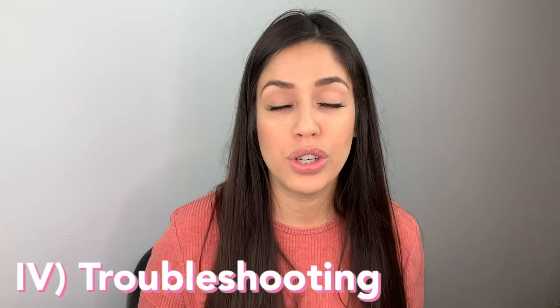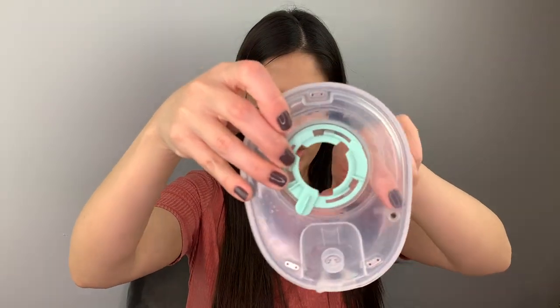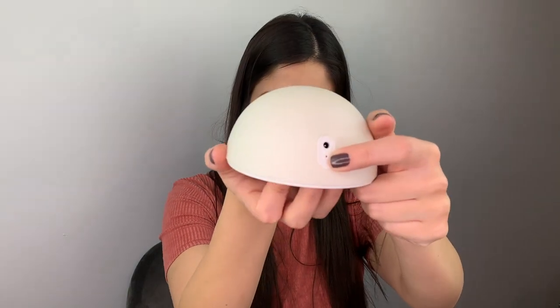Moving on to the troubleshooting part. This worked probably two or three times before I had to troubleshoot. What I did first was run it under hot water — making sure it dripped from the valve. The second step was to close the Willow pump app and restart it. The third thing was to restart the pumps using a paper clip in the small hole to reset both pumps.